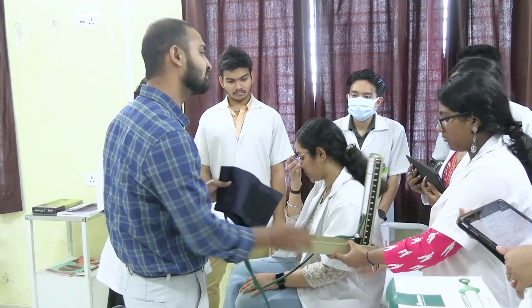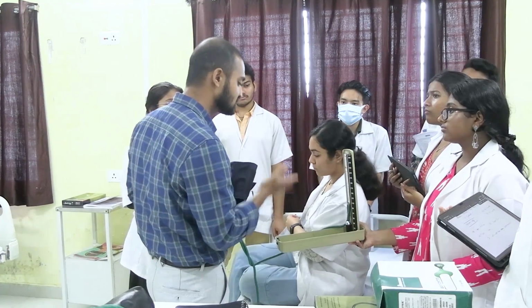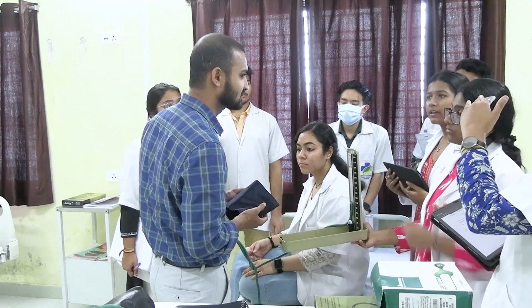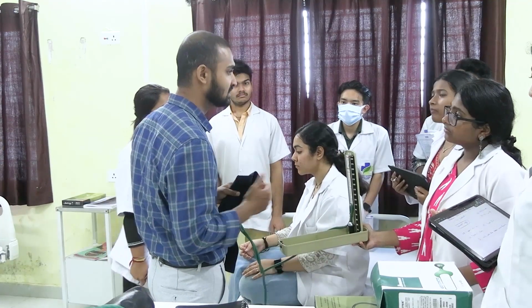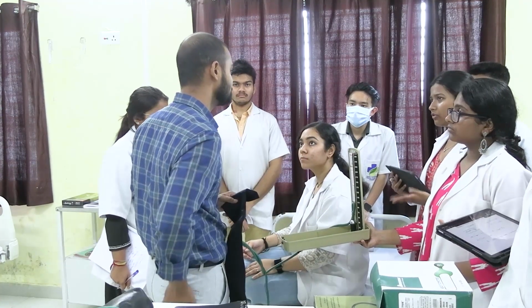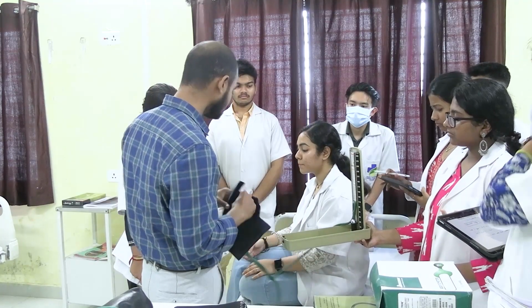What will happen if I keep the machine below the level of the heart? Because of the effect of gravity, the BP will be more. It will give an excess result. And what will happen if the machine is above? Low. Same, due to the effect of gravity.